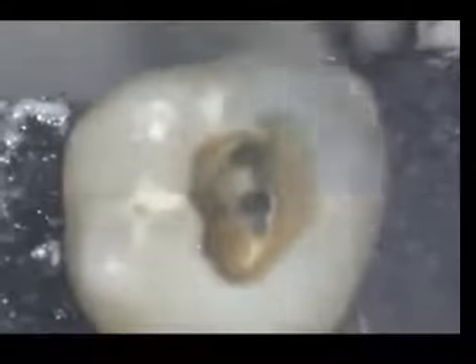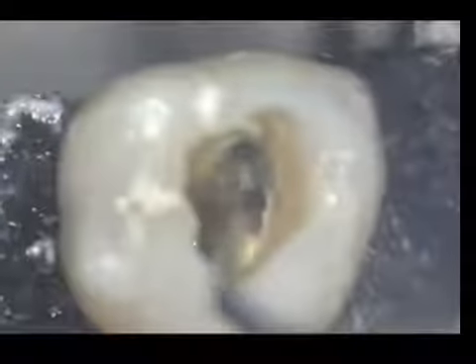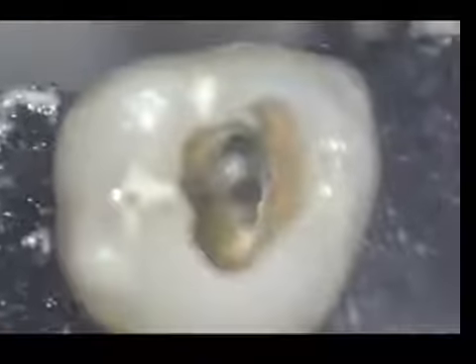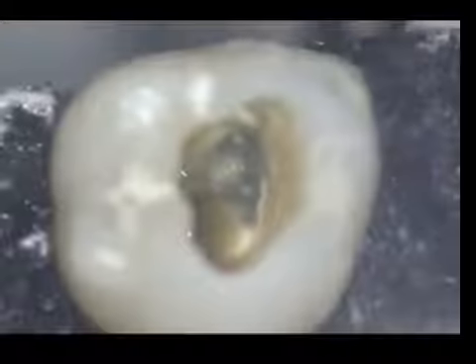There is an isthmus between MB1 and MB2 that I check with an explorer to make sure it is hard tissue, not harboring an additional canal — that it is not an additional space where a sheath of tissue exists. Probing with a reamer only allows me to remove a small amount of extra tissue on one of the walls. I do not find a probable space.